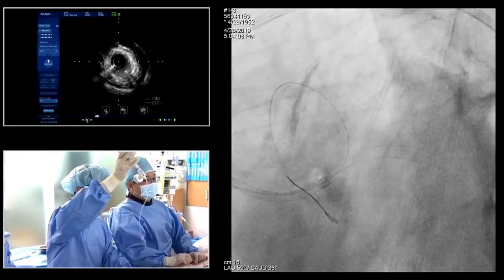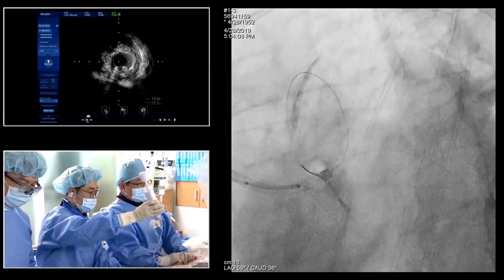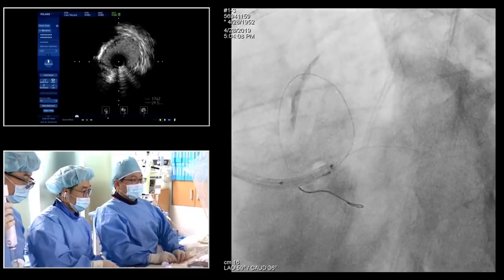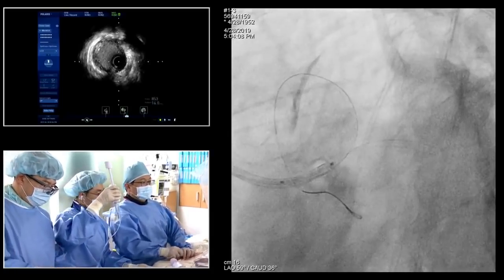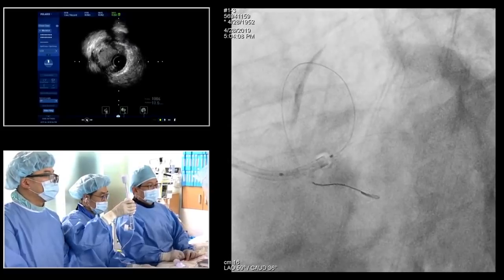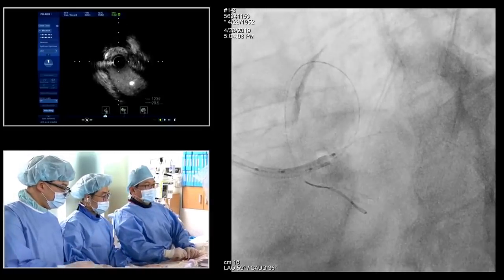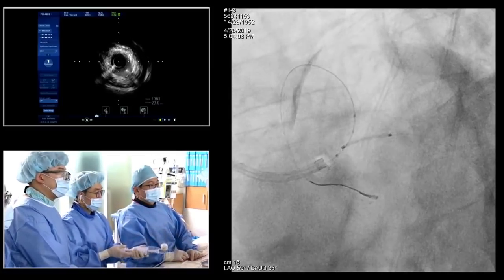Personally, I don't favor directional atherectomy, but some Japanese physicians will favor it. Particularly, this patient has a relatively mild calcification, considering the etiology of Takayasu arteritis. So some interventional cardiologists in Japan will consider. I think this is an ideal case. It's not very calcific, a lot of plaque burden, large vessels. I think you get really an excellent stent result if you remove the plaque with DCA.